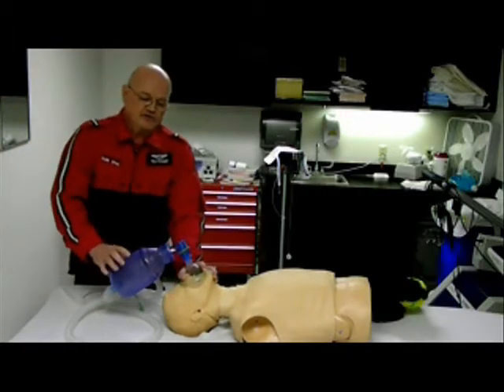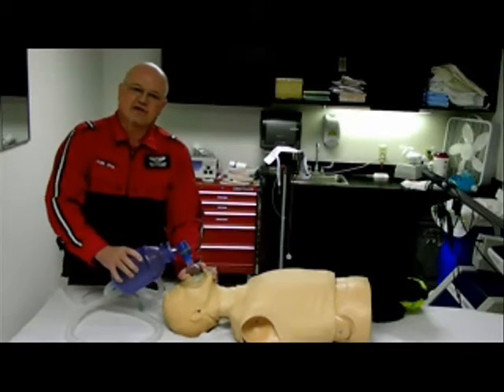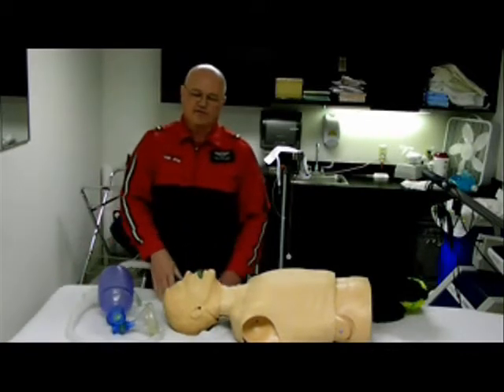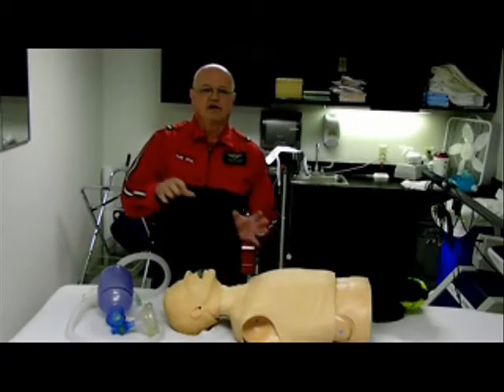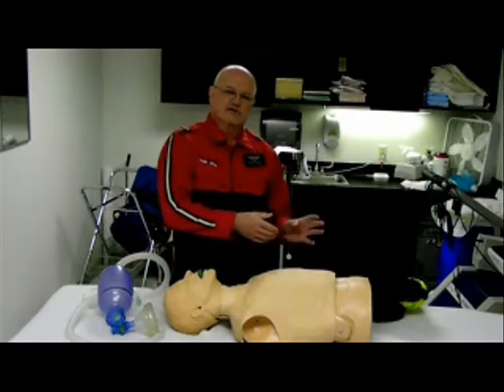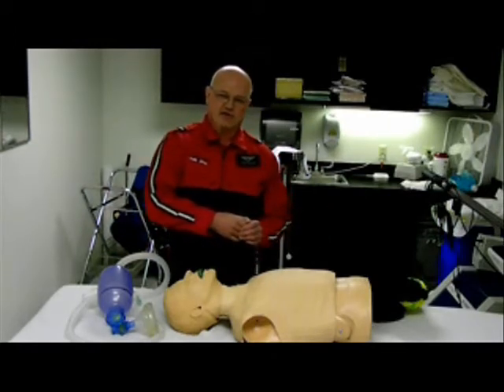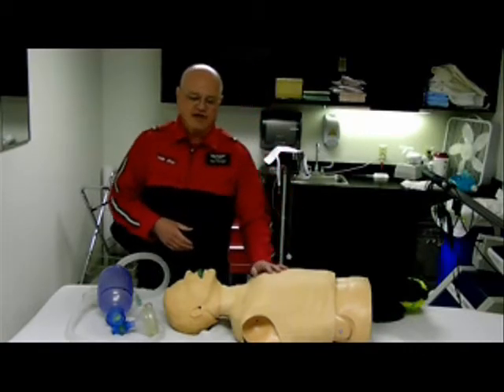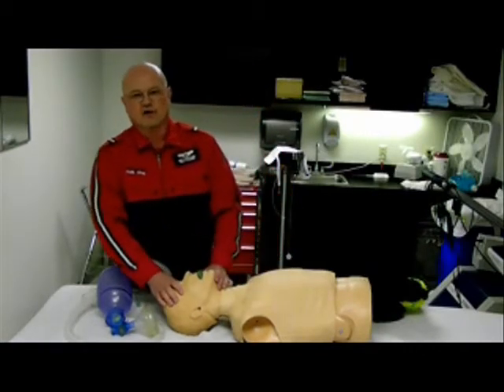If we use all of the bag — the whole 1,500 cc's — what will happen is the lungs will fill with the 500 to 800 cc's, and the rest will just enter the stomach, causing gastric distension, interfering with ventilation, possibly causing aspiration, and then of course they're going to vomit all over you.